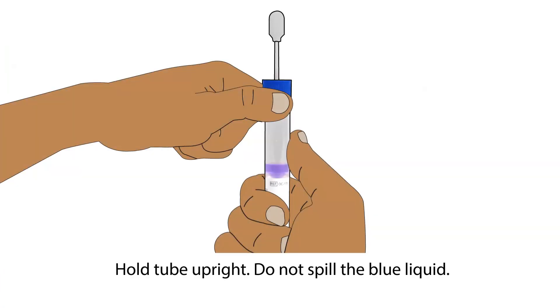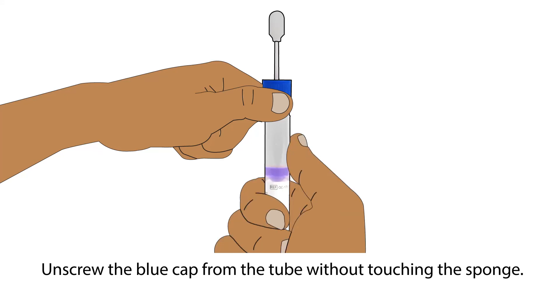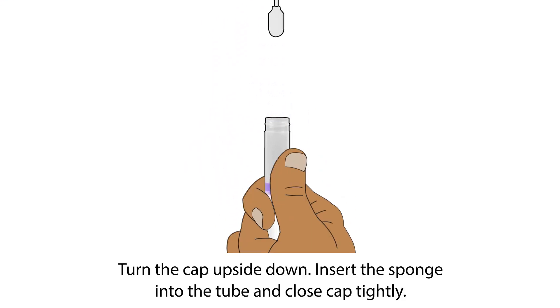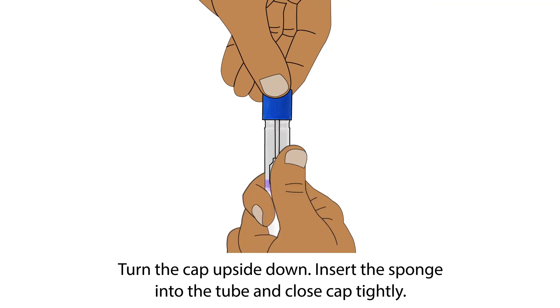Hold the tube upright to prevent the blue liquid inside the tube from spilling. Unscrew the blue cap from the tube without touching the sponge. Turn the cap upside down, insert the sponge into the tube, and close the cap tightly.